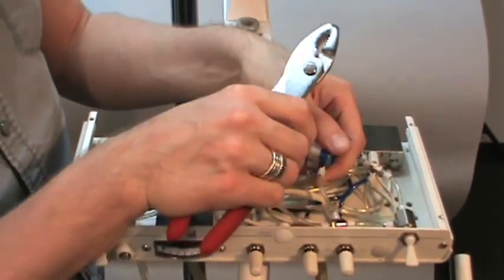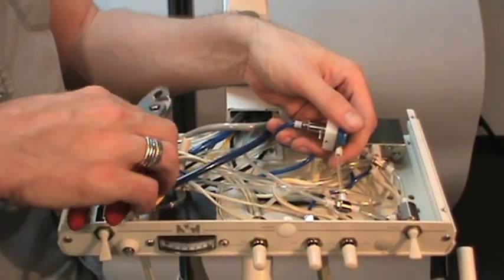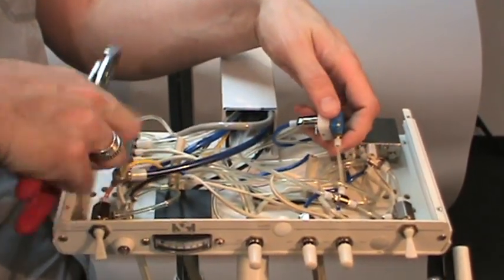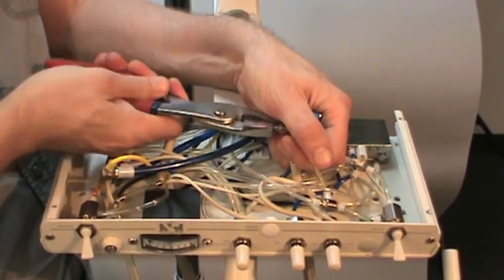The old valve may be cut out, or you can use a wrench or extracting forceps to slide the tubing clamps back, and then pull off the tubing as seen here. It's a good idea to trim the tubing ends if you decide to go this route.